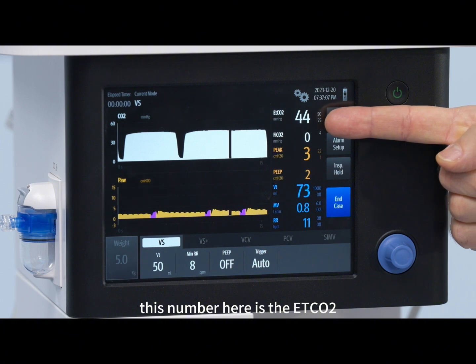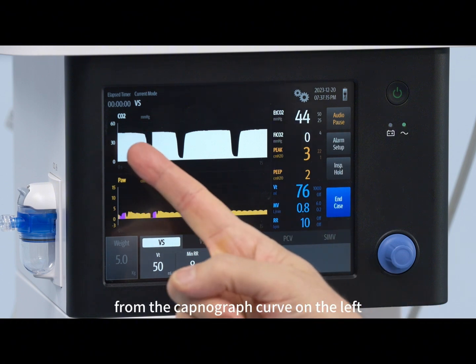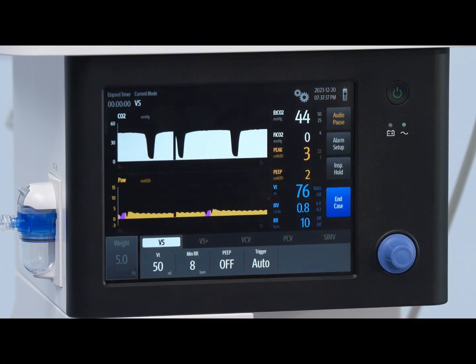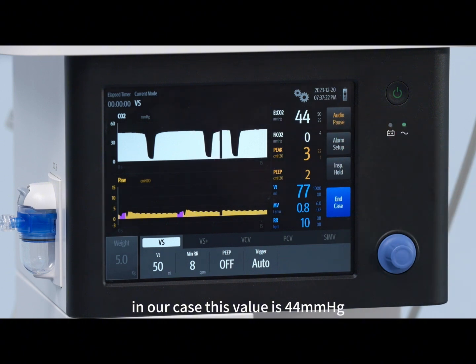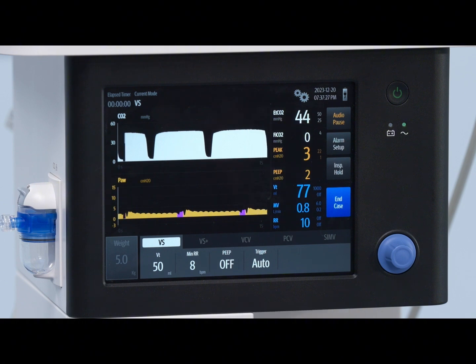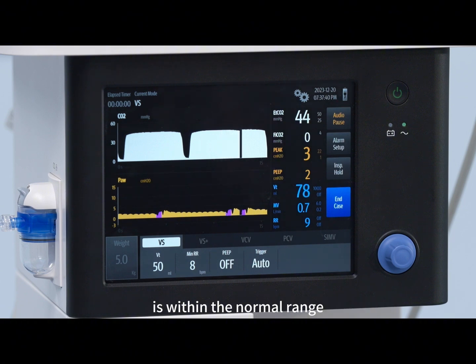This number here is the ETCO2, which means end tidal CO2. This value is derived from the Capnograph curve on the left. In our case, this value is 44 millimeters of mercury. We use end tidal CO2 to define ventilation. The normal range in dogs is 35 to 45 millimeters of mercury. It means that the end tidal CO2 value of this dog, which is currently being anesthetized, is within the normal range, so the dog is normal ventilating.